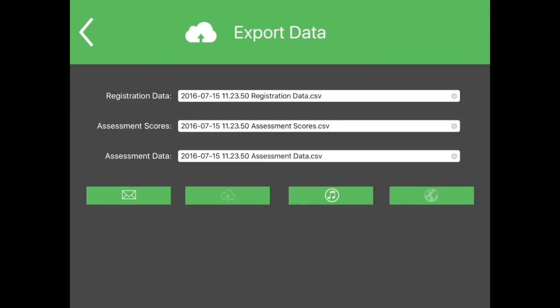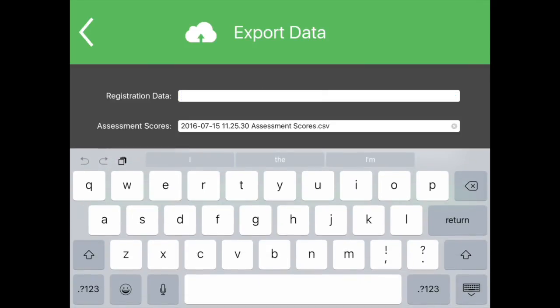Registration data, assessment data, and assessment scores. You can choose to edit the name of the file by touching anywhere in the text field, clearing the default file, and typing in a new name.